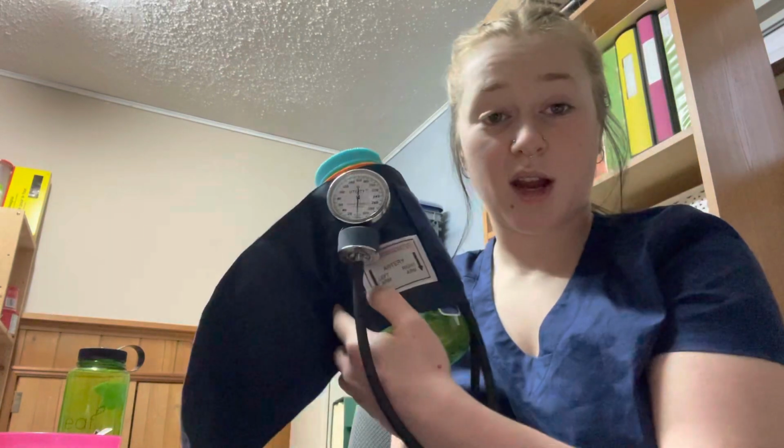So what I'm going to do is I'm going to apply the cuff here. When applying the cuff on an actual patient, it's important to make sure that you align the artery with one of these arrows, depending on which arm you are applying the blood pressure cuff to. And the blood pressure cuff should be located about an inch above the crease of the elbow and shouldn't be too tight. If it doesn't fit properly, you're going to get inaccurate pulse readings, pressure readings. So, keep sliding on me. There we go. All right.